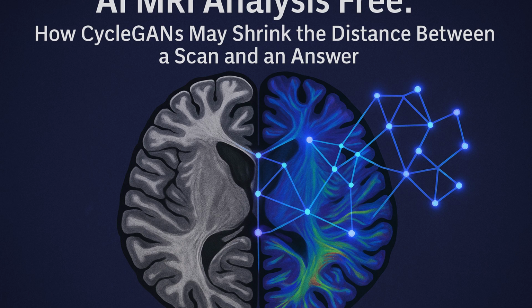Acronyms, promises. So we tried to make a kind of map of what's out there, trying to separate the hype from the real tools, the paid stuff from the genuinely free. Okay, what did that map look like? Well, we looked at companies like Qure.ai, Aidoc. They have FDA-cleared tools. Mostly for CT scans in emergency rooms, right? Triage tools. Yeah, things like qER from Qure or Aidoc's neuro tools used in hospitals, FDA-cleared. But definitely enterprise solutions. Big bucks. Not free for you or me.